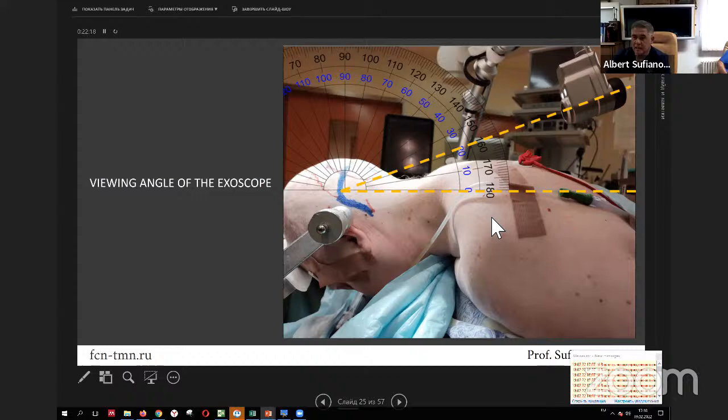And in this slide, you see the advantages of the exoscope. It's possible to create the trajectory completely close to the spine, at the back of the neck. You see, it's possible to make it parallel to the surface of the cerebellum, so there's no need for more retraction of the cerebellum. It's very important. With a microscope it's not possible like this. With a microscope you see like this, maximum. With the exoscope there is no limit.